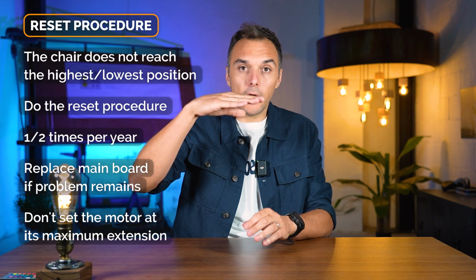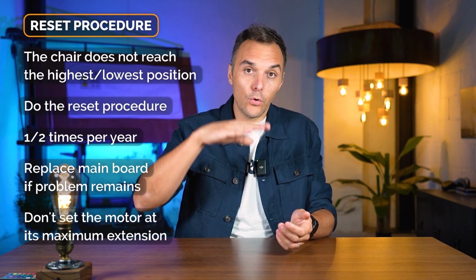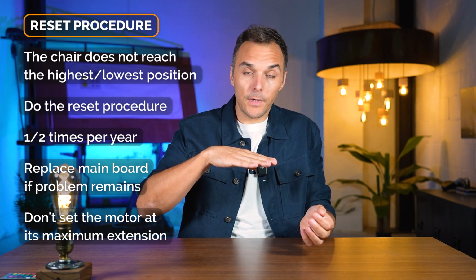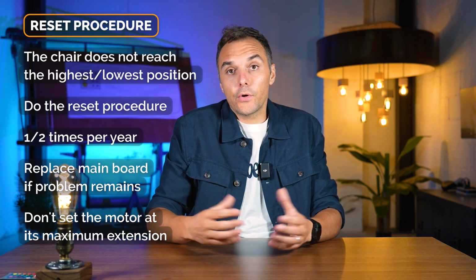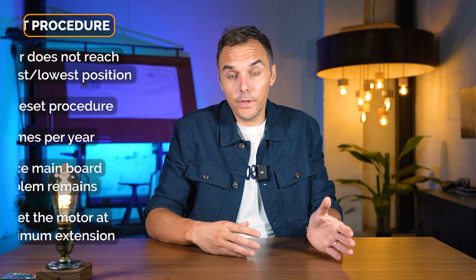So you reach the upper limit and you go down just a bit, and the same for the lower position of the seat and the backrest as well. You reach the limit, the lower one, and then you come up a little bit. In this way the motor is not working fully and is better, because it doesn't create any possible alternative problems to the dental unit.